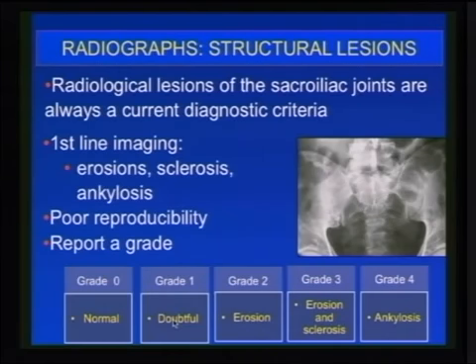If you suspect sclerosis, erosion or narrowing, just label it as indefinite or a doubtful case. Look for the other findings, and make sure that you are not missing anything, especially at the sacroiliac joint. If you see that bowel loops are masking those joints, you are really at a doubtful stage, so just keep it at either 0 or 1. If you see something definite, just grade it.